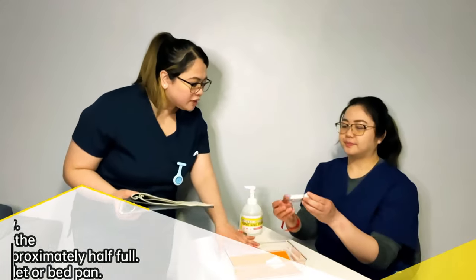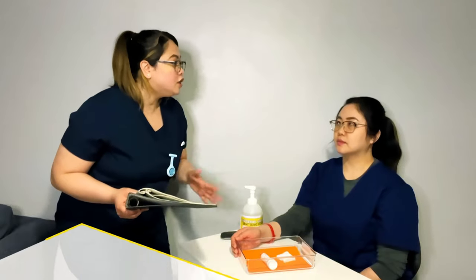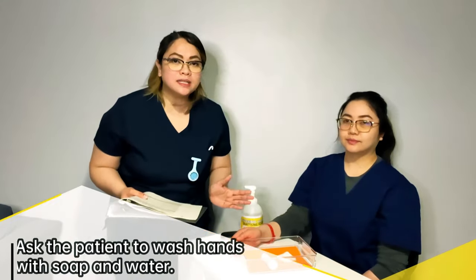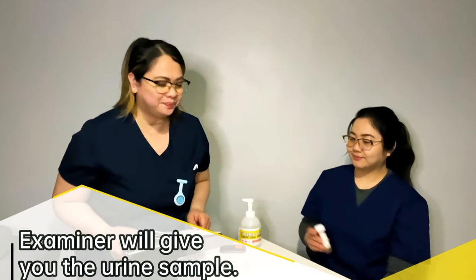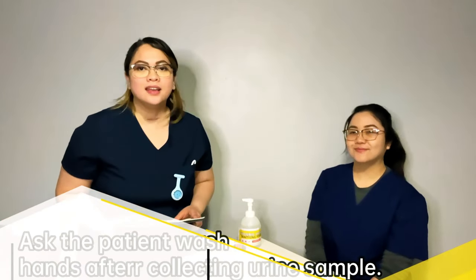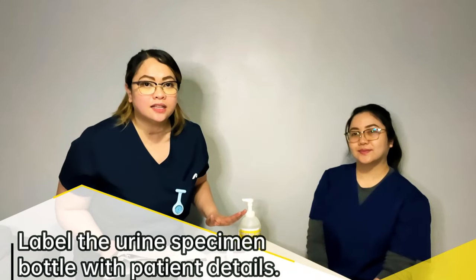Thank you. Don't forget the swab right there. Thank you. So before doing that, I'm gonna need you to wash your hands first, okay? Okay. And then transfer the specimen into a sterile universal container. This is the point in which the examiner will hand you over this specimen collected, and then allow the patient to wash their hands. Then you get to label the specimen bottle with the patient details. Just a tip, you can do this before even giving the bottle to the patient.